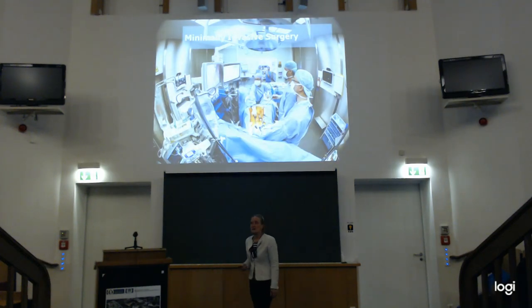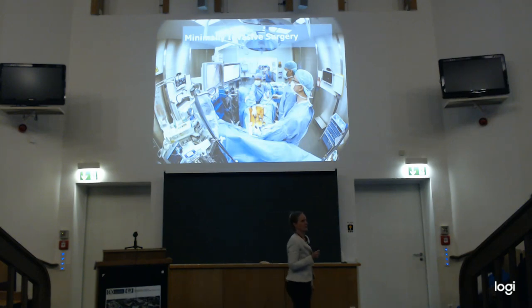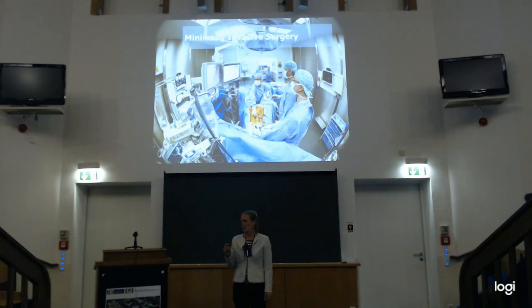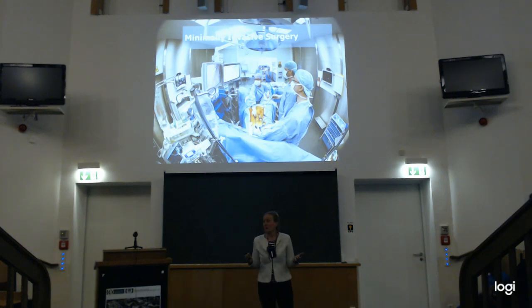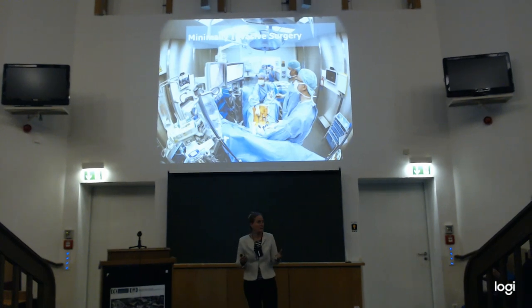So, why minimally invasive surgery? There was a group working on this laparoscopic tools. We tried to aim to make patients better by reducing the incision, but mainly by reducing the amount of damage to healthy tissue. We want to treat patients with less damage, because then they are quicker healthy again, quicker back to work, with less chance of infections. Not so long in the hospital and bring them back to work as we all want. So that's how we do minimally invasive surgery, and we try to make this incision even smaller, make new tools that can have more functions through an even tinier incision. That's what we try to do.